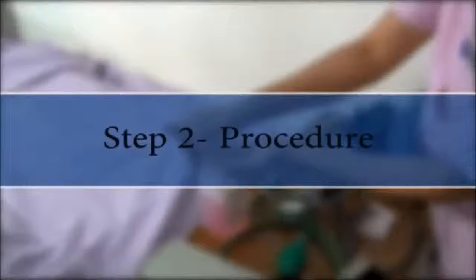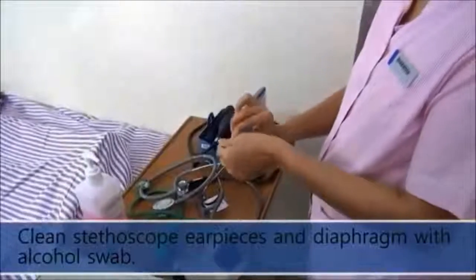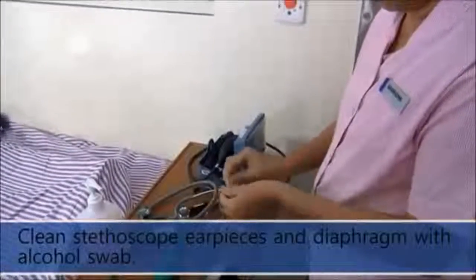Step 2. Procedure. Wash your hands with alcohol solution. Clean stethoscope earpieces and diaphragm with alcohol swab.